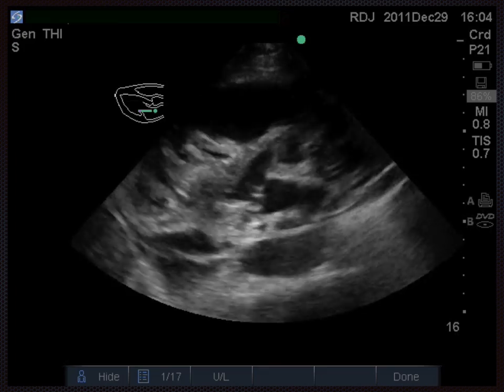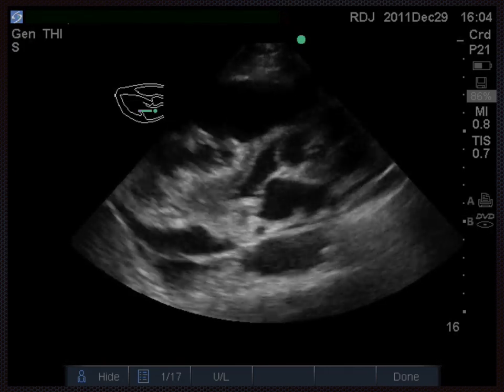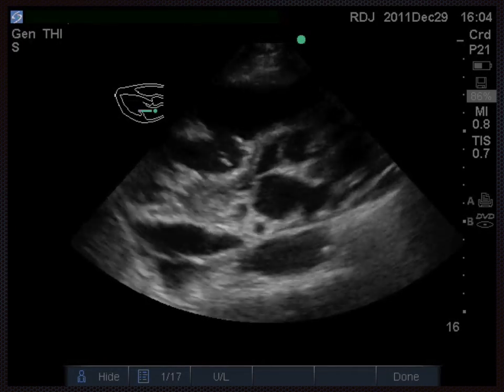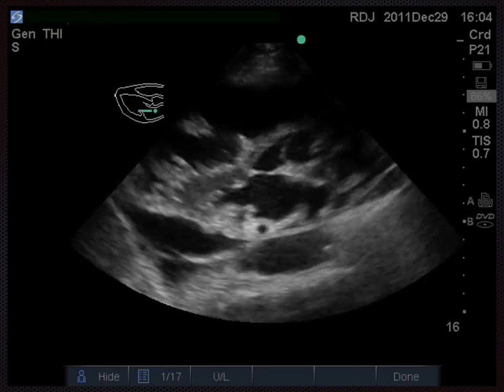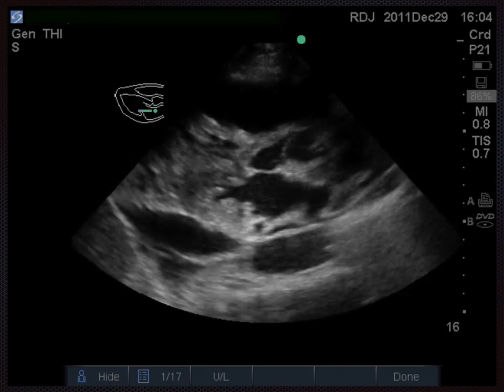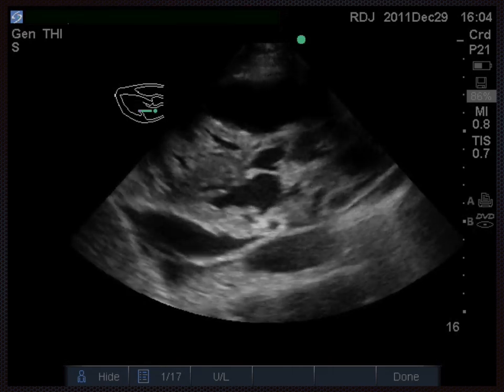Can you see that this is a parasternal long axis? So, for instance, imagine yourself in an emergency department. It's late at night, the department's very busy, and this patient's being radio called in with deteriorating blood pressure and looks like they're in extremis and about to die.